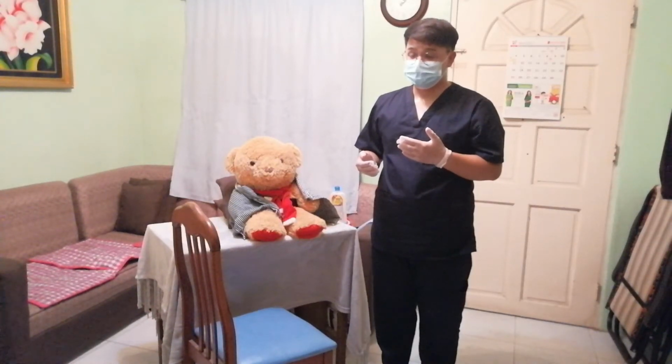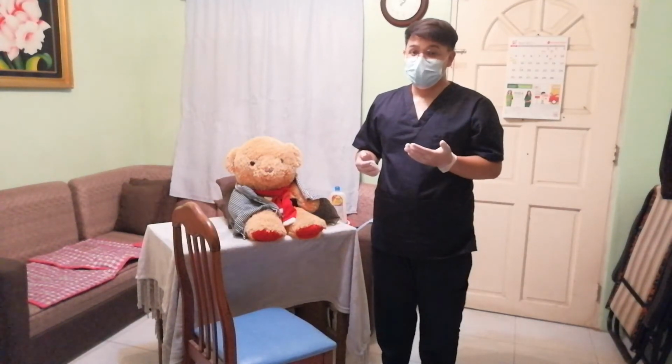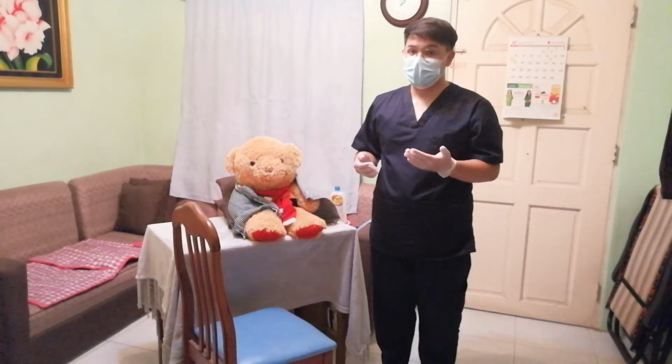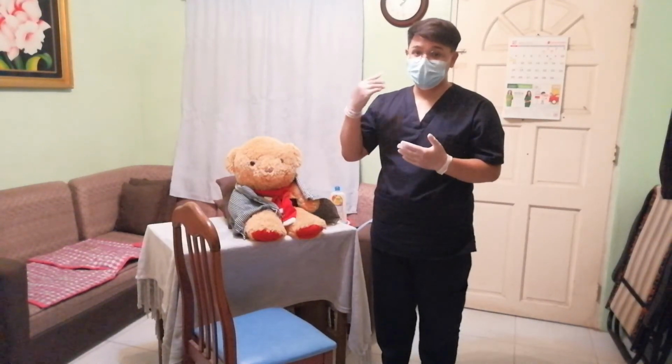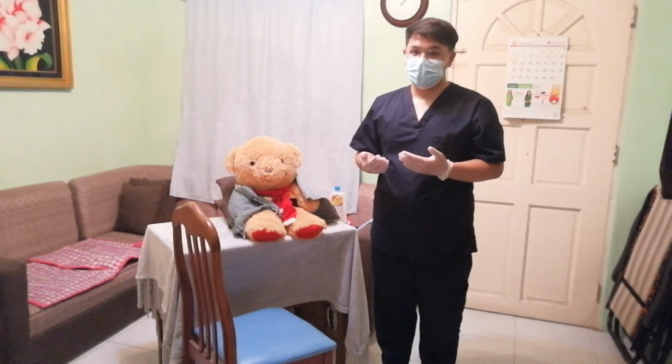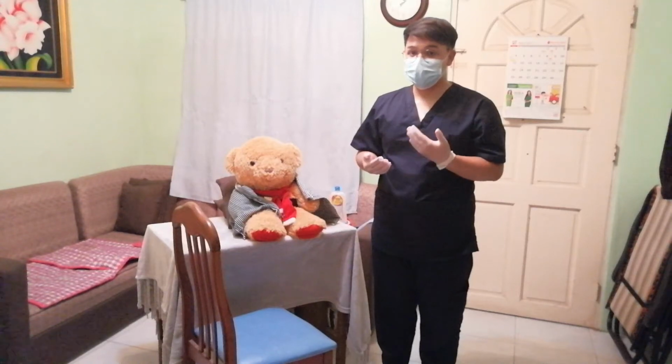And after that, we need to rock back and forth, and we need to count 1 to 3. And on the count of 3, we will be using our legs, not our back, to help the patient into a standing position.